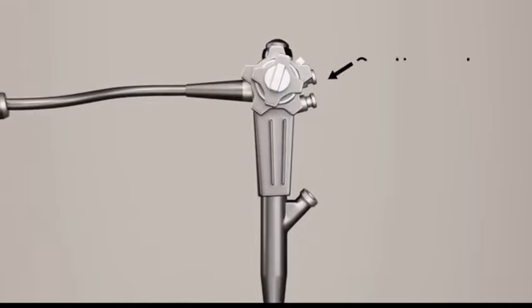Suction valve. When depressed, this aspirates air or fluid through the distal tip. This is connected to the accessory channel. A biopsy cap needs to be in situ covering the accessory channel for the endoscope to generate the suction needed. Biopsy channel opening. This allows passage of biopsy forceps and other instruments to undertake therapy. This is covered by the biopsy cap, which creates an airtight seal necessary for the suction channel to operate.